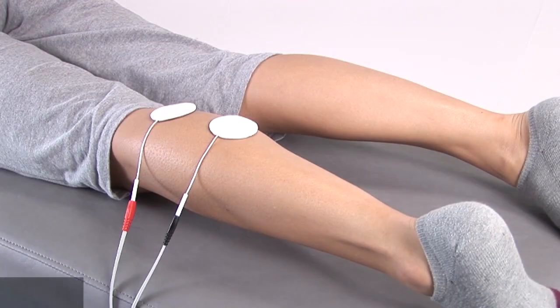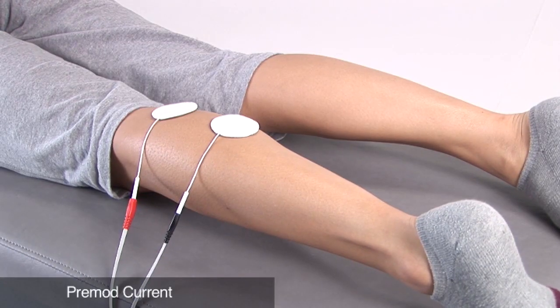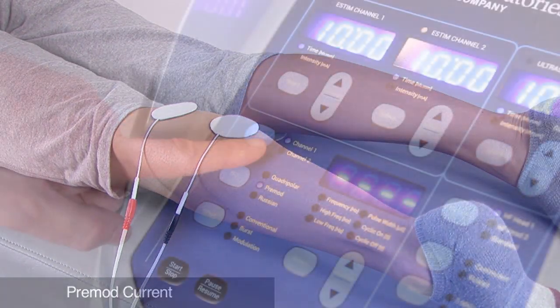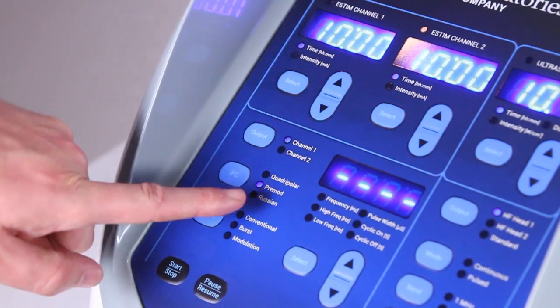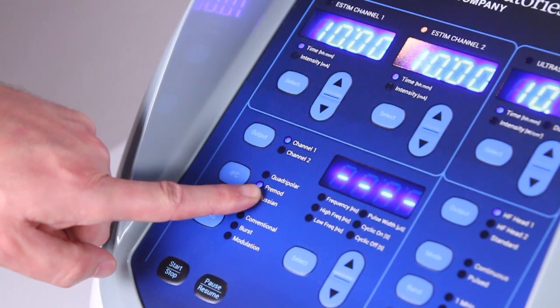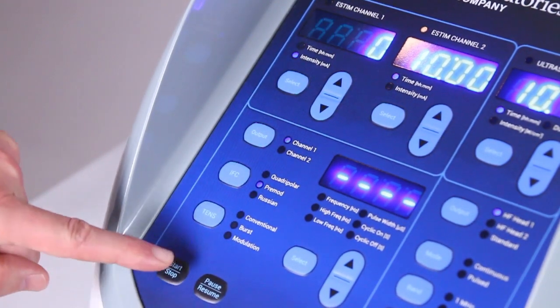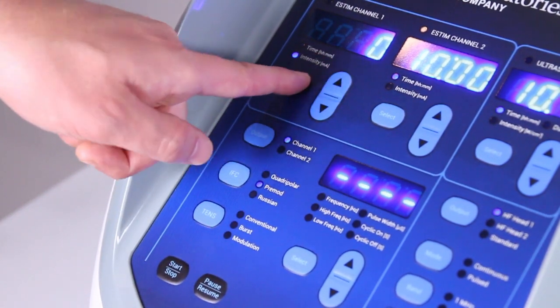To use pre mod treatment for a smaller area, position two electrodes on your patient and select channel one and pre mod. Start the treatment and set the time and intensity using the up and down arrows.